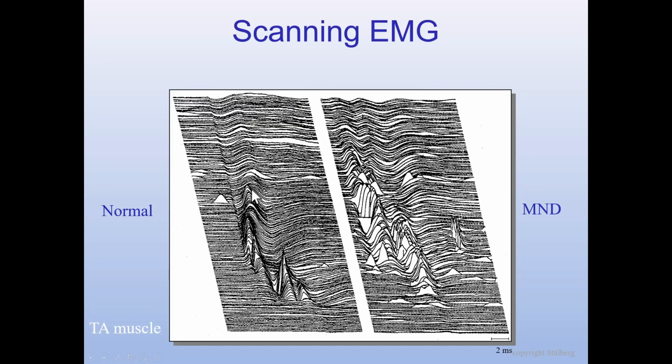And here is again a scanning picture where we have the whole thing 20 millimeters, and you see the different shapes that we see in the scanning. In normal EMG we insert the needle here somewhere and record only one of these sites.